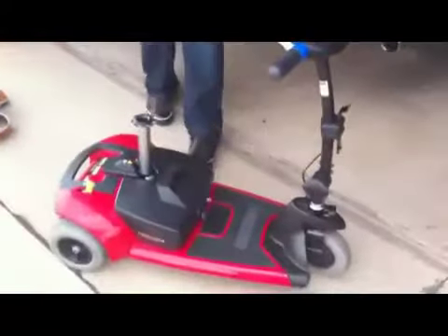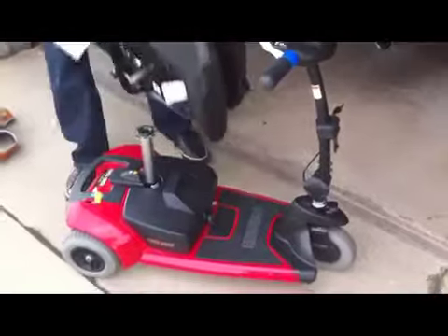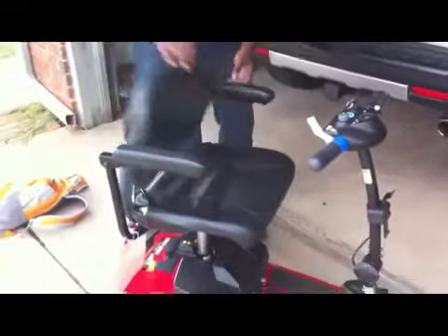That's the battery right there, and that's a dry cell battery. And for airlines — there goes the seat — the airlines require you to have a dry cell battery for it to be allowed on the airplane.